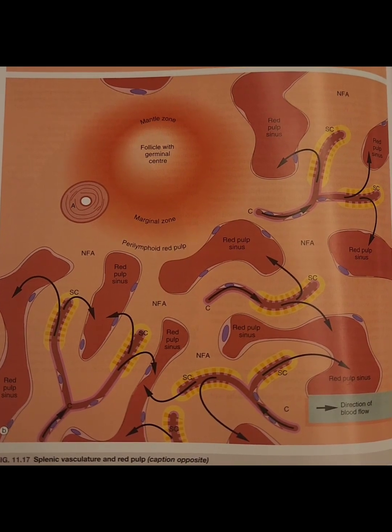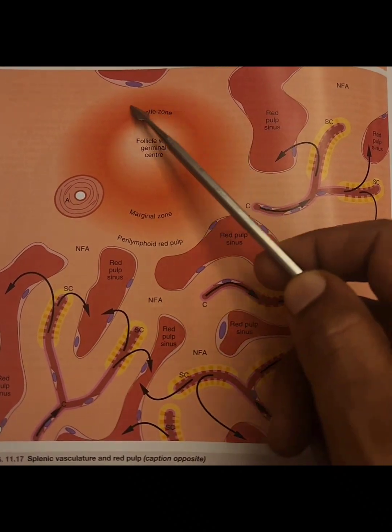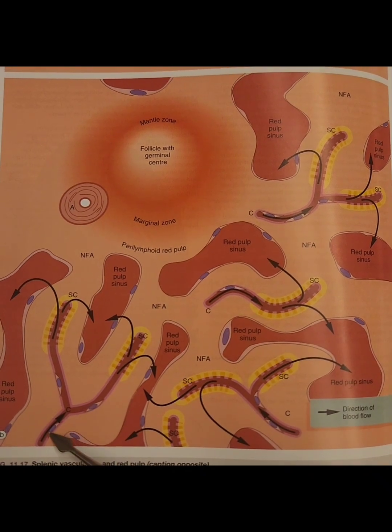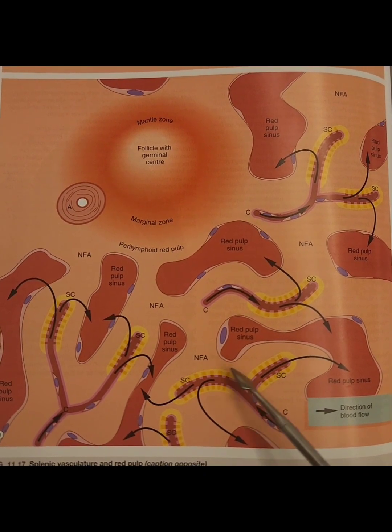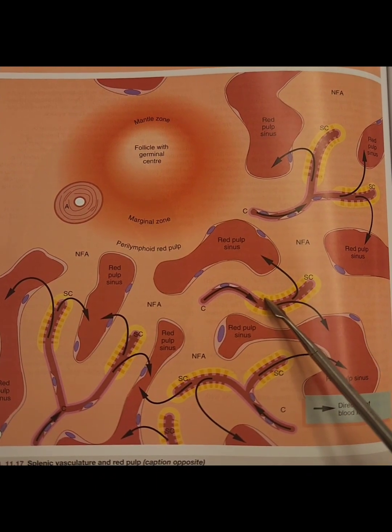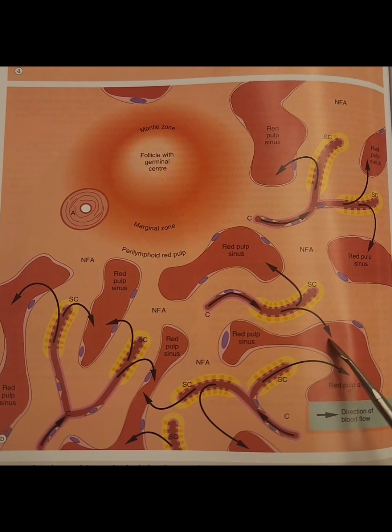Let us understand with this picture. This is white pulp, lymphatic aggregation, eccentrically placed arteriole. These are distal parts of the penicillar vessels, capillaries, sheaths of macrophages, sheathed capillaries. All these are splenic sinusoids.